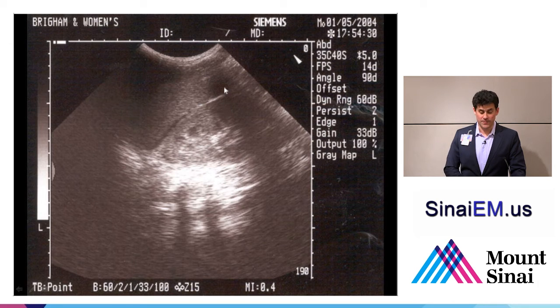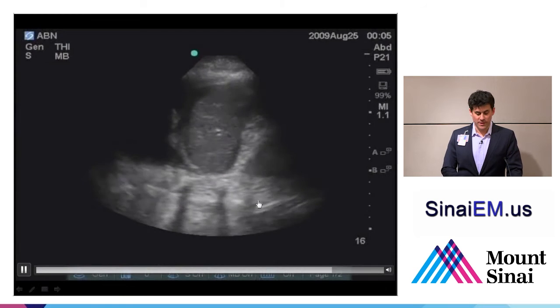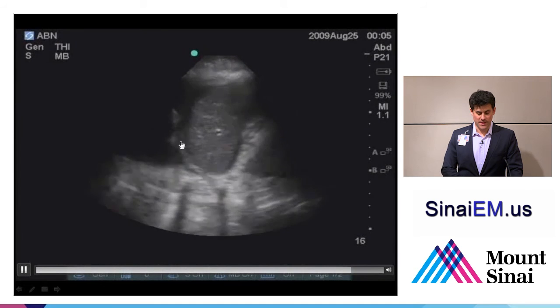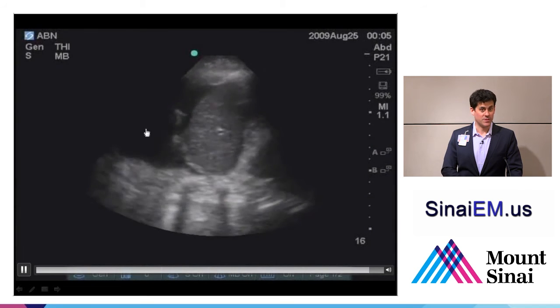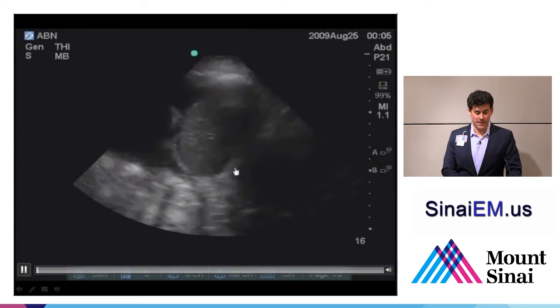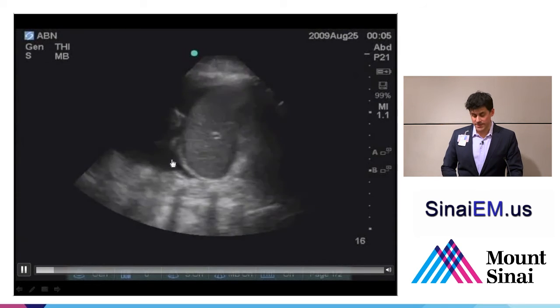There are a lot of areas between the spleen and the kidney here that actually look pretty normal. So again, just getting an image where you can see the spleen and the kidney touching each other does not exclude fluid in the left upper quadrant unless you're really scanning back and forth through the entire view of the spleen. So here's an example of a patient who has both fluid around the spleen as well as above the spleen. There's the diaphragm, this bright white line extending vertically in the screen, and above the diaphragm, we see fluid up in the thorax as well. So this patient has peritoneal fluid, evidenced by black highlighting around the spleen, as well as pleural fluid above the diaphragm.